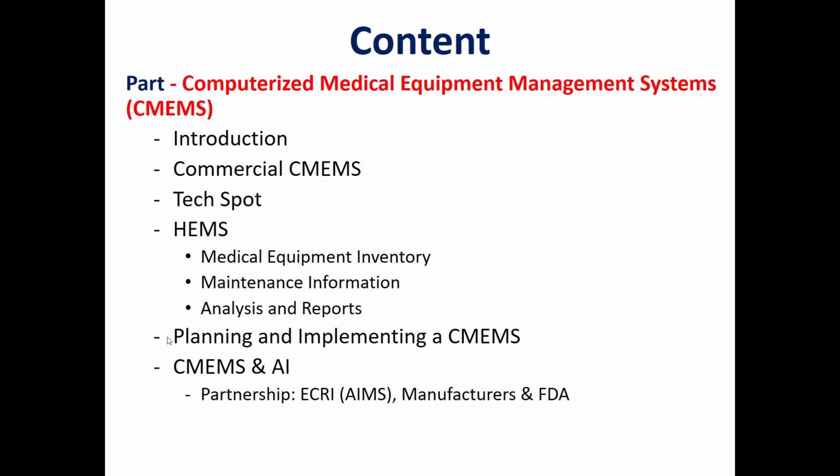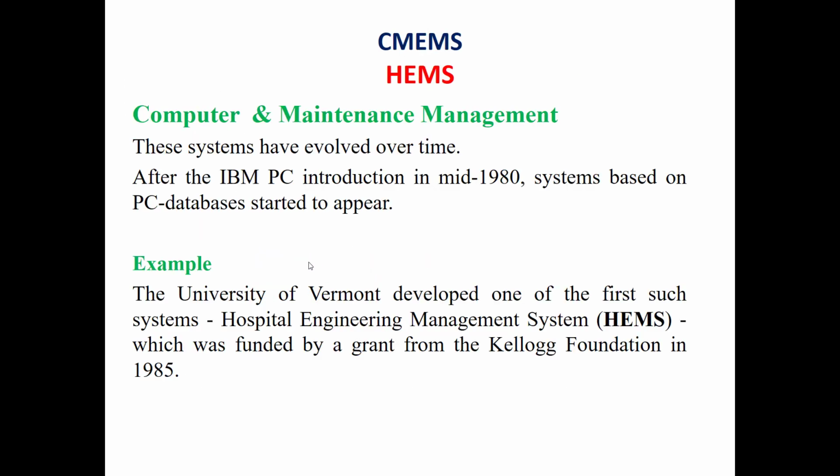Then we will talk about the planning for a new computerized medical equipment management system, the points which we should consider during the planning for such a system, and how to implement this system. Now we'll start with this practical example.